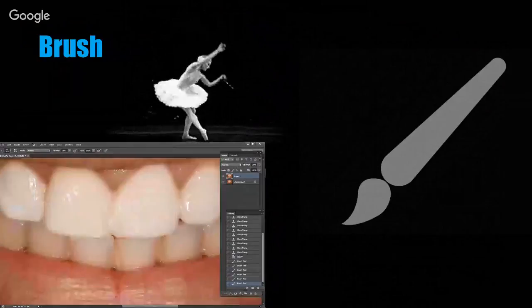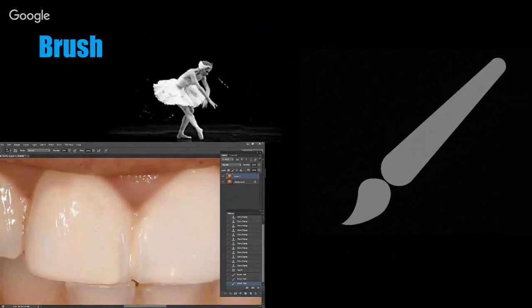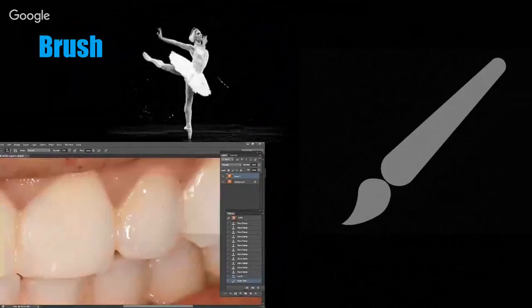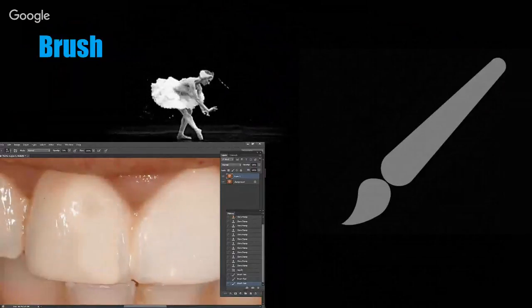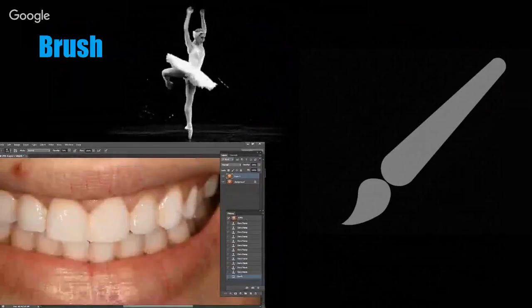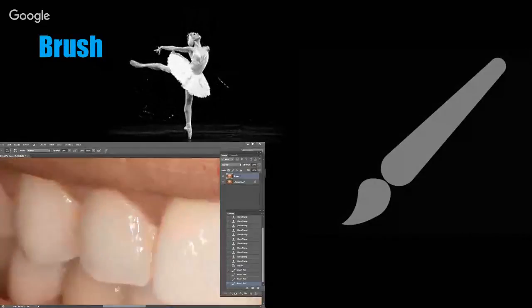If you use those four tools, you can perform any smile simulation you want. You can perform enameloplasty if you want to straighten up an incisal edge. You can perform a gingivectomy. You could perform a virtual composite restoration. You can test the position of certain transitional line angles if you want before starting the treatment. Maybe you want to make a tooth look slimmer. Maybe you want to make a tooth look wider. You can test that on a composite restoration before you even begin.